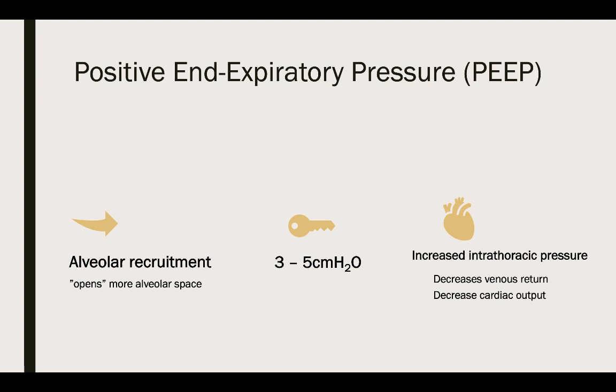Next thing we're going to set is our PEEP, our positive end expiratory pressure. So we've set our rate, we've set our volume, and we need to set our PEEP, and we need PEEP for alveolar recruitment. We need our alveoli to stay open in between breaths, so we need a little bit of PEEP. We generate just normal PEEP every single day. Just sitting here breathing, you're generating some PEEP, probably 2 or 3 centimeters of water, give or take, just sitting here on the couch.